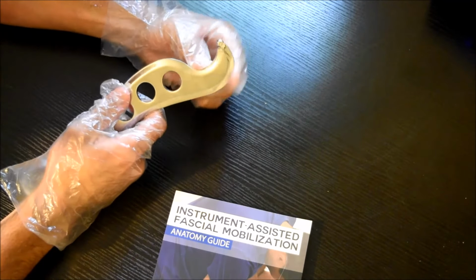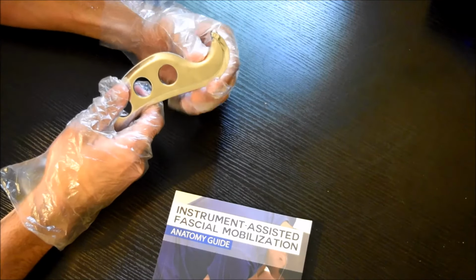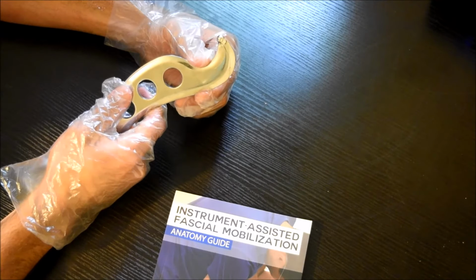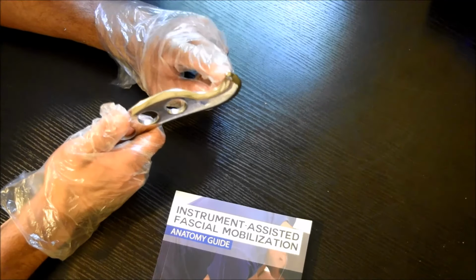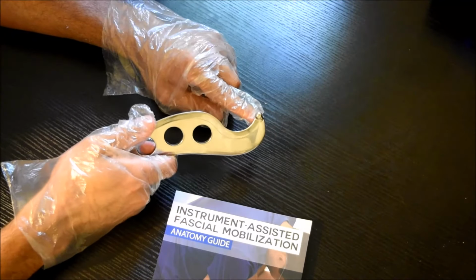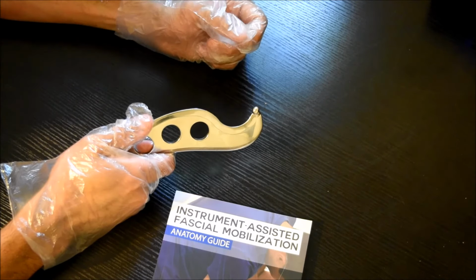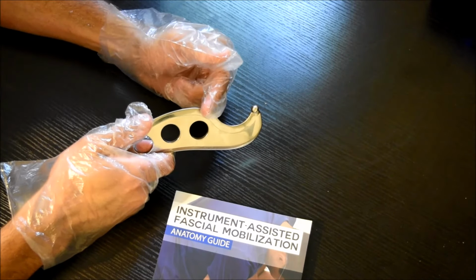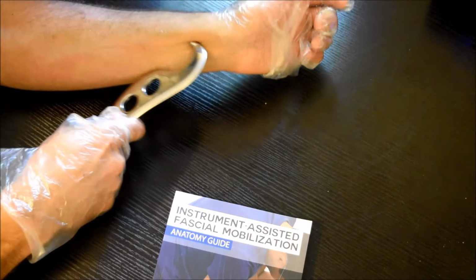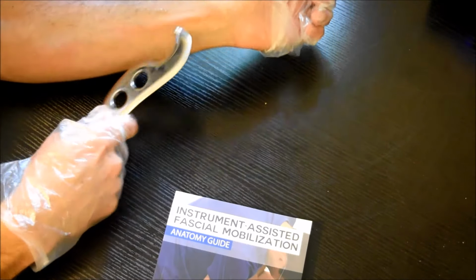And we've got this medium convex edge, which you can also use for other semi-specific areas. And we've got the accusphere. The accusphere is great for getting in between tendons. I like to use that for areas between the semitendinosus and the semimembranosus in the hamstrings, between the IT band and the hamstrings. You can also floss between tendons in the anterior forearm near the carpal tunnel.